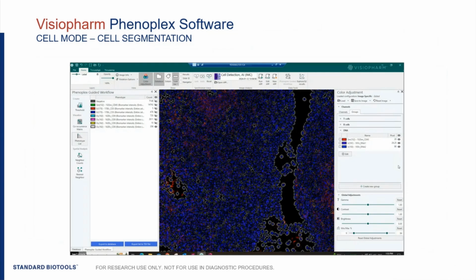So to do this, you first start off by using the cell detection app. It utilizes AI to automatically identify individual nuclei and cells, and it can be used for batch analysis for all your image data. We find the segmentation app actually quite accurate when analyzing our data.